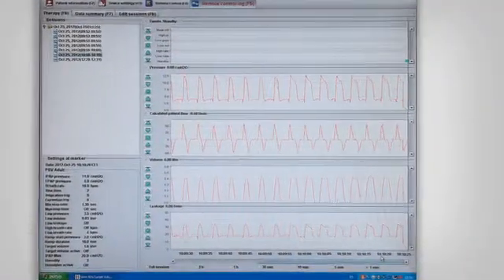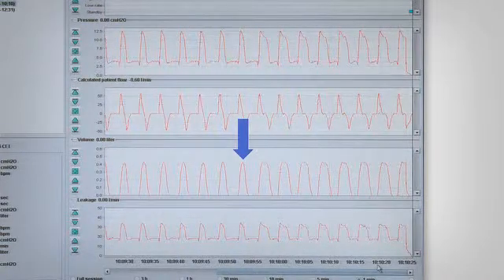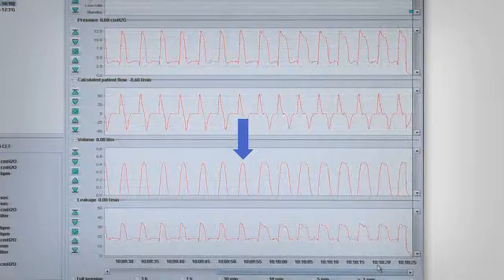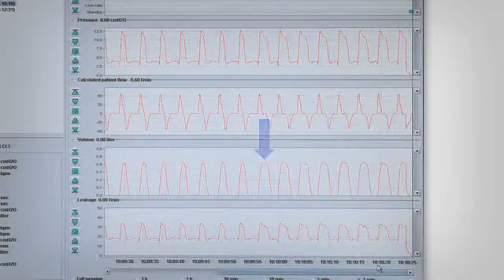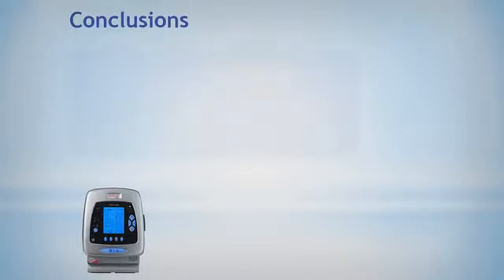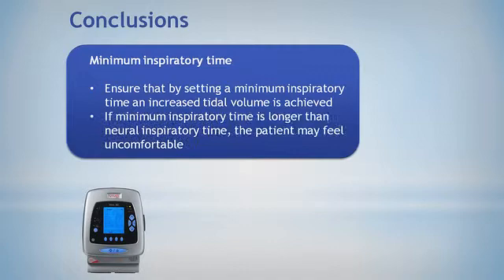Let's analyze what happens if we select a minimal inspiratory time of 1.3 seconds. The first breaths are flow cycled at 10% of peak flow. When we select the minimal inspiratory time, the inspiratory time is clearly longer, but you may appreciate that the volume gain is really low. We must ensure that setting a minimum inspiratory time actually achieves an increase in the delivered tidal volume. Moreover, if we select a minimum inspiratory time longer than the neural inspiratory time, the patient may feel uncomfortable with the ventilator.